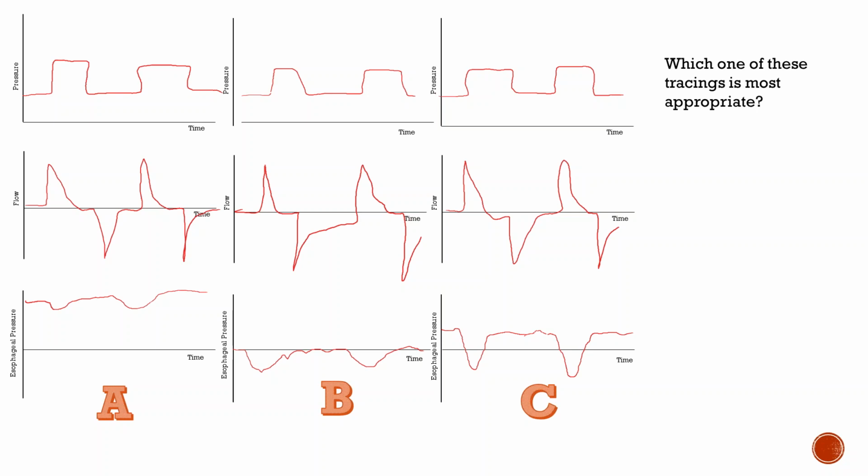So you can use the esophageal pressure at the end of inspiration, which is right here, to help guide what your true plateau pressure is.